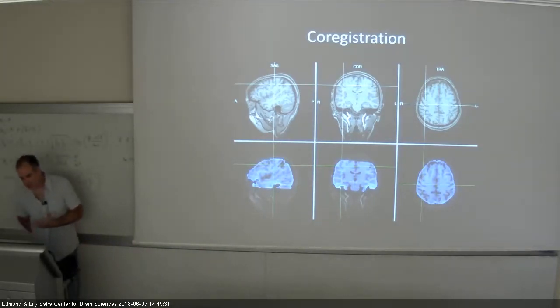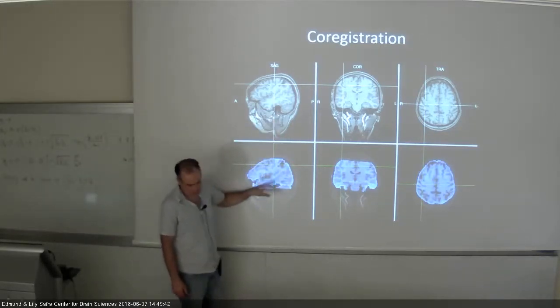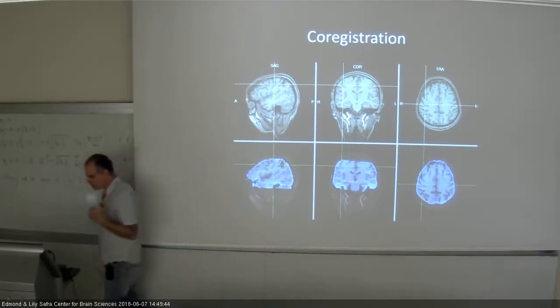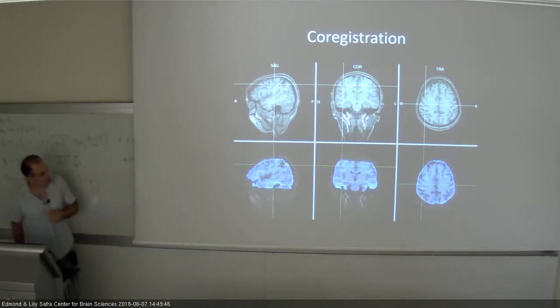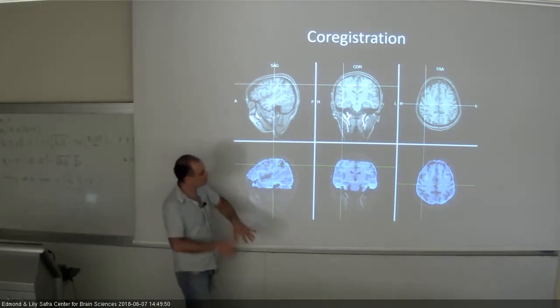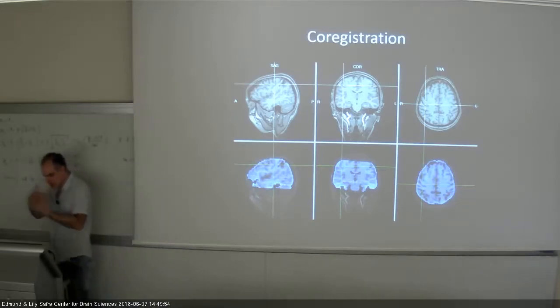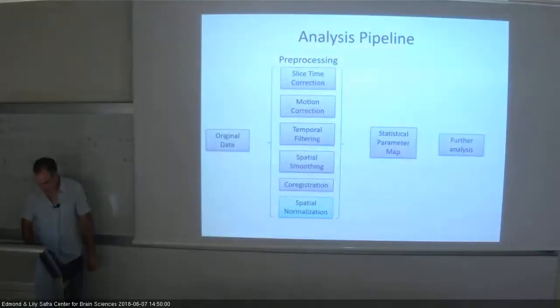And again, luckily today, we have very, very successful algorithms that detect these kinds of landmarks and intensity changes in the MRI, in the anatomical maps and the T2 star maps, and they do a transformation to put everything in its right place, okay? And there's a bunch of header files that connect your two types of data.